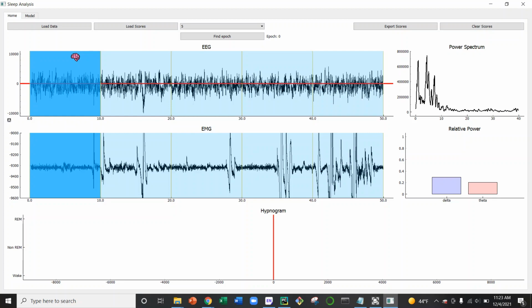The short version is that we do a lot of sleep studies, but right now we score all the data by hand in 10-second bins. And that takes a really long time when you consider that we get 7+ days of continuous recordings. So we're talking about millions of data points, tens of thousands of 10-second bins or epochs. So it takes a long time.